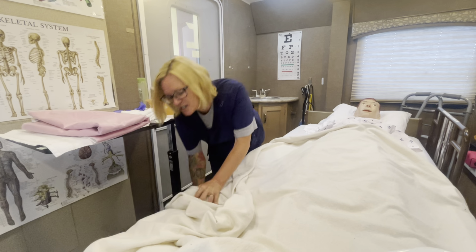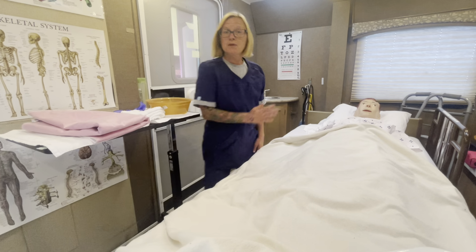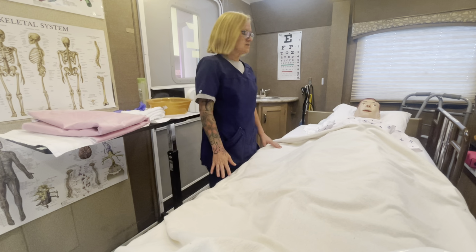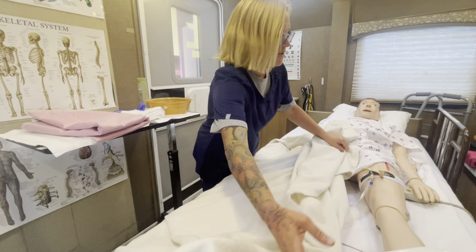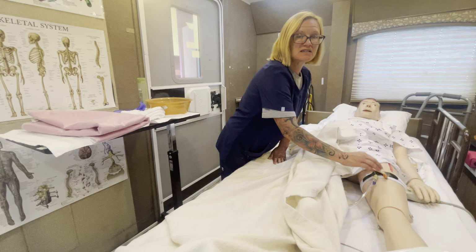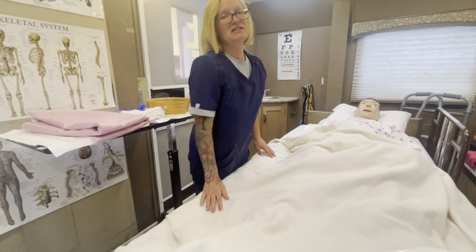The next thing is you want to make sure that this is always on the bed frame. You don't want it on any part of the bed that is moving, like when the patient moves the head up and down. We want to make sure it's on the frame and not anything else. And the third thing that you need to know is that they should always have a holder for the catheter. As you can see, she has a holder that is a Velcro one. This will keep the catheter in place so that there's no tugging. There's different kinds, and I've even seen people use transparent tape.